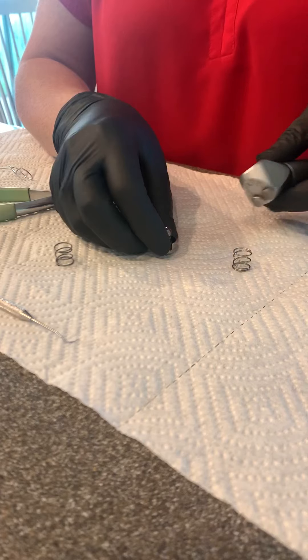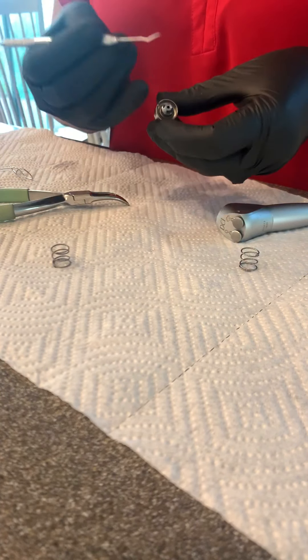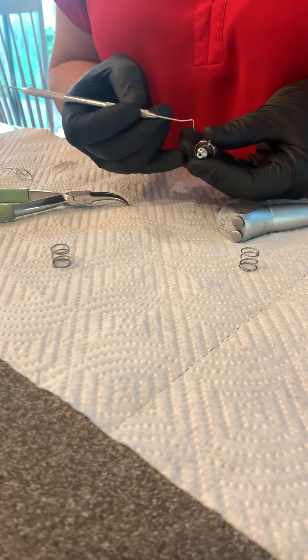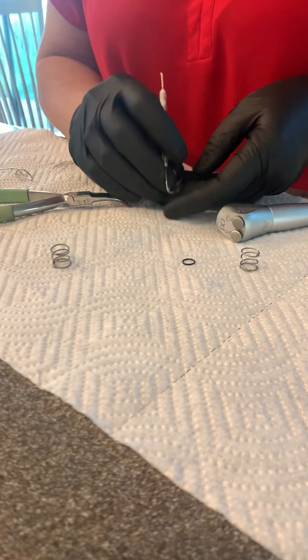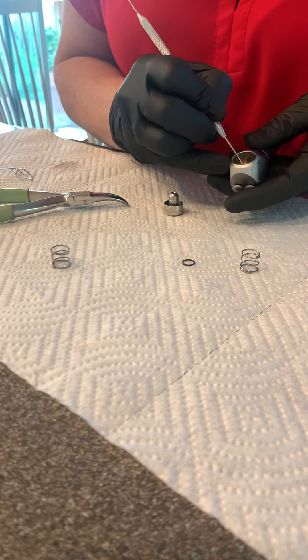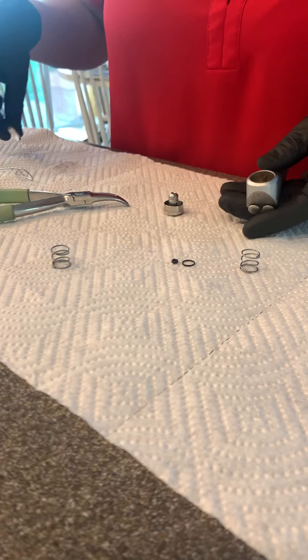You see the spring? I use an explorer for this. There is an O-ring on your syringe, and there's a second O-ring that's inside the syringe. These three things are also in your kit.